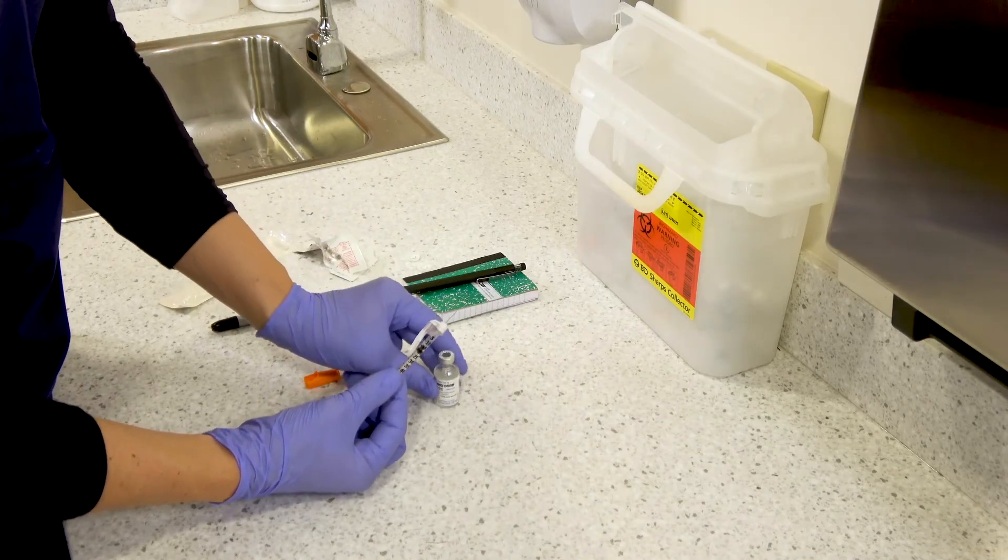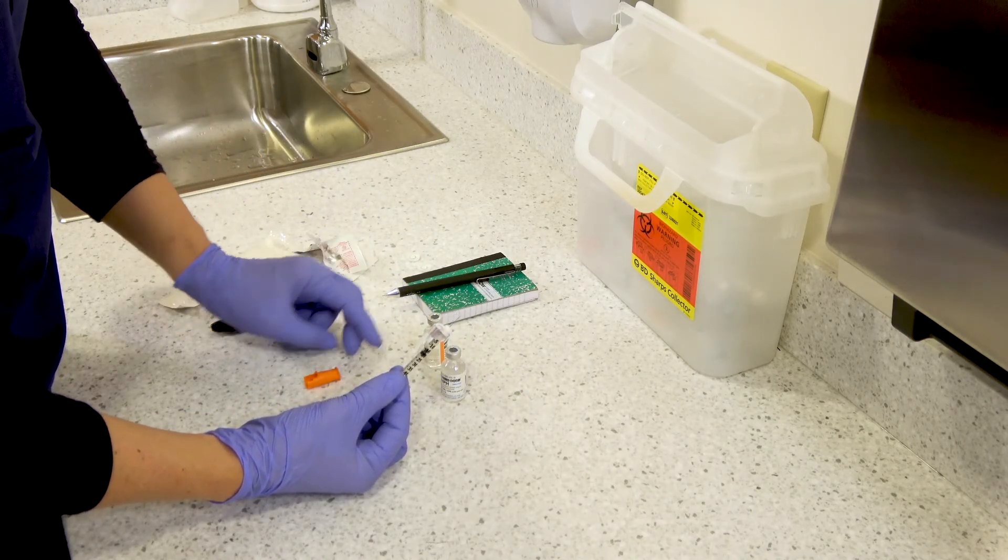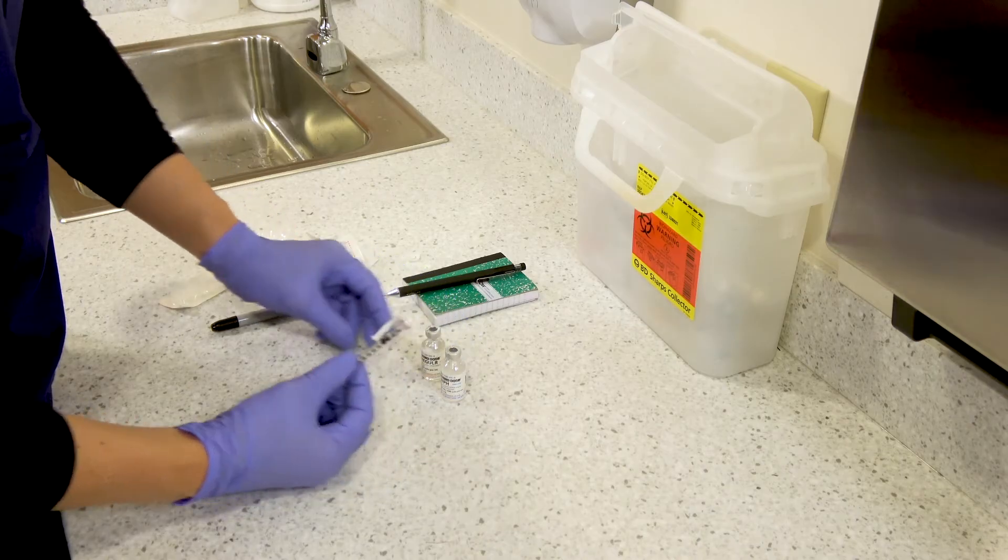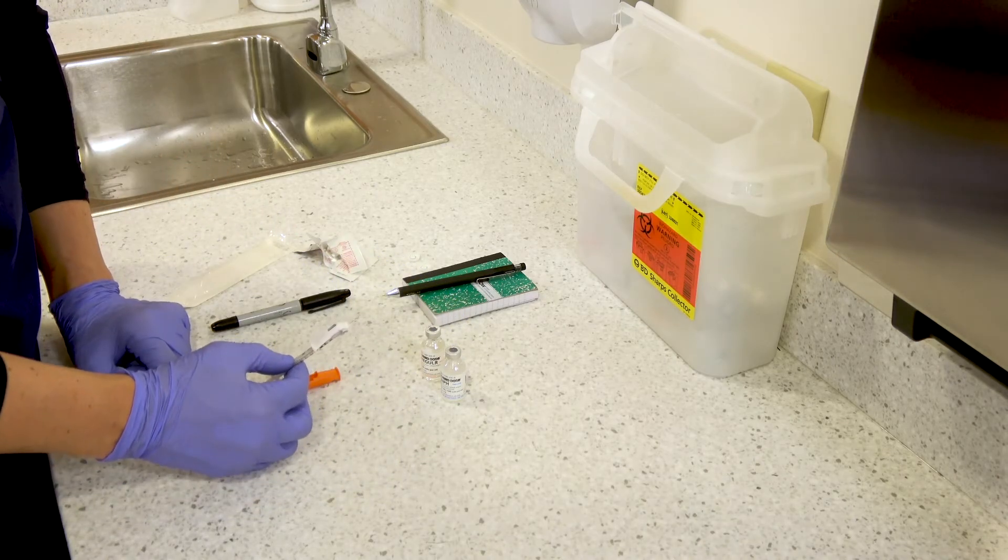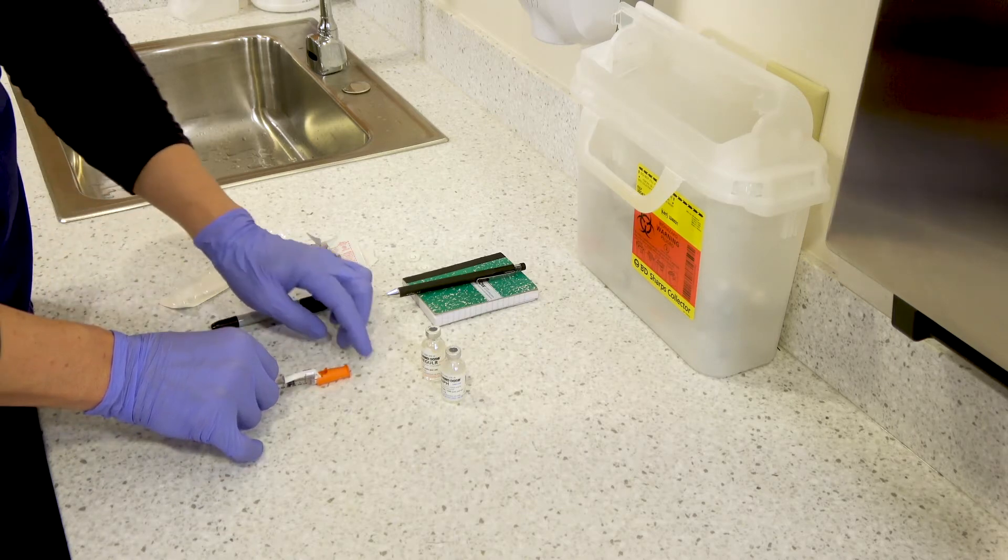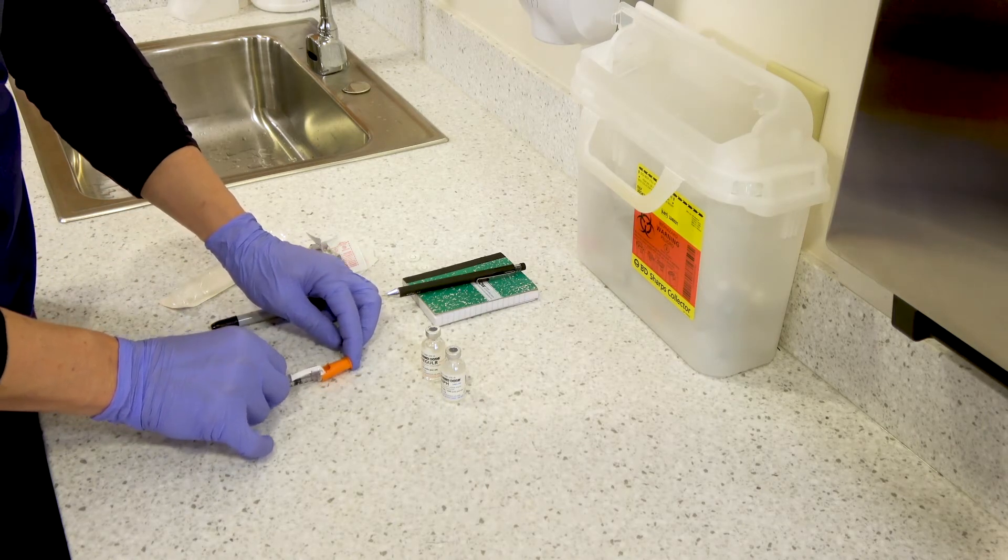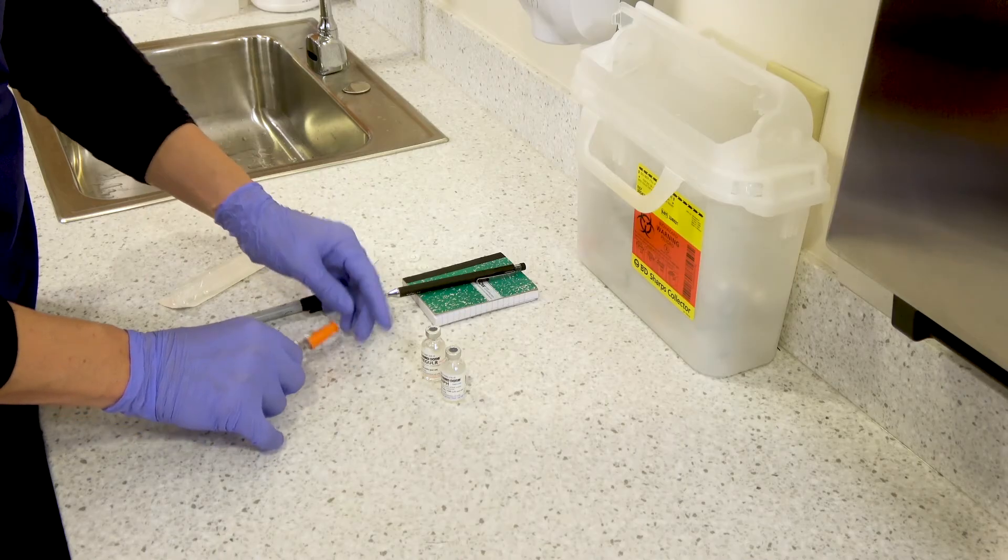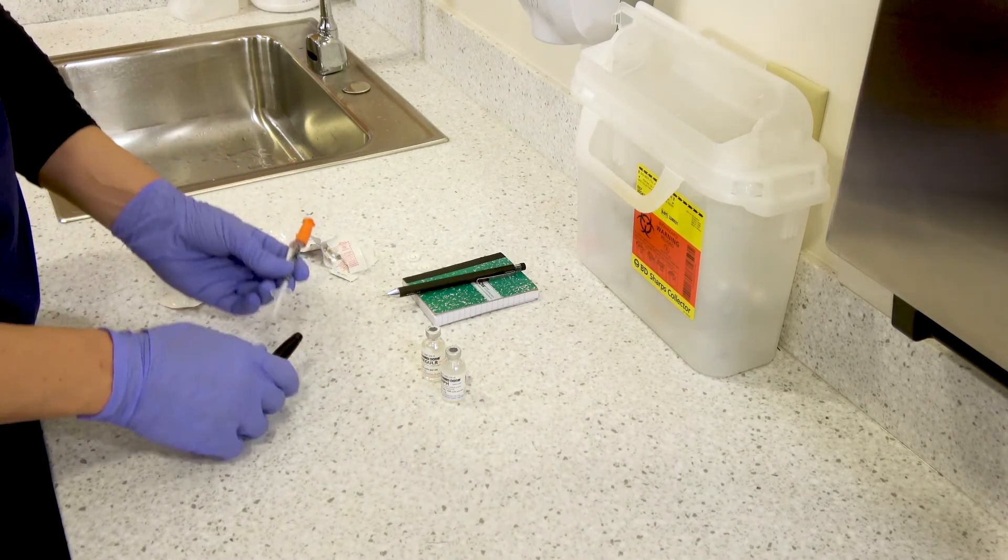If you accidentally overdraw you'll need to start over because you can't inject it back in and it's already mixed. So remove the needle from the NPH vial and prepare to administer it to the patient. If you aren't administering it right away, recap it and label the syringe with the drugs and doses, date, time, and your initials.